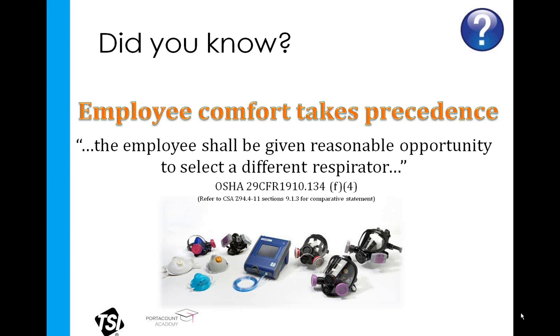Now, it is the responsibility of the employer to provide the option for different respirators if the employee finds the prescribed respirator too uncomfortable to perform their duties. And I would say that during that 5-minute user assessment comfort period, that is time that you can use to be describing the fit testing exercises to the employee. It is also time that you can use the real-time fit factor display function of the PortaCount to verify that that respirator is fitting, and that is discussed in other online webinars.